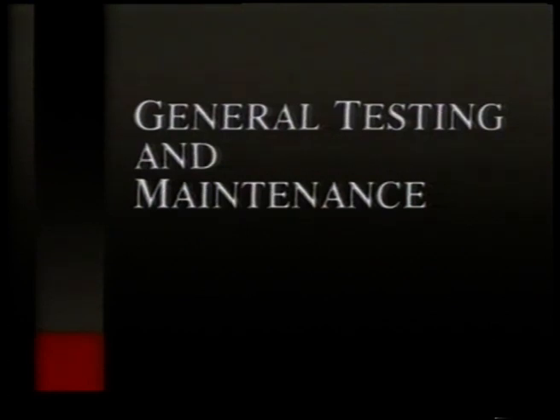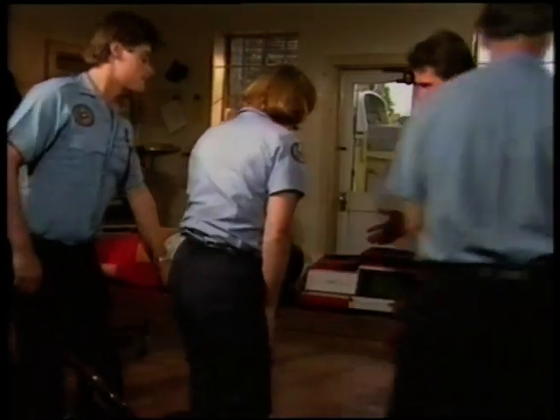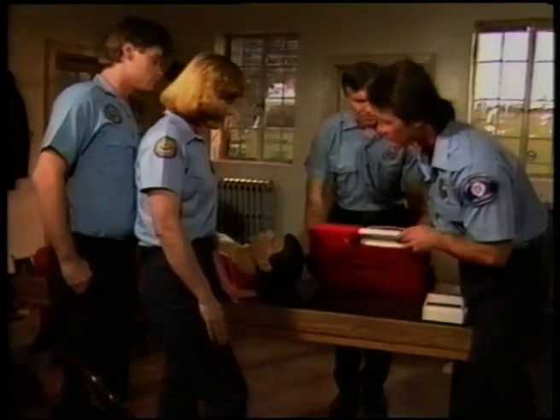The following information is a guideline for testing the functional and electrical safety of the defibrillator monitor. It does not replace the need for a full inspection by a qualified service representative. If the LIFEPAK 300 fails to exhibit appropriate responses during testing, it should be checked by a qualified service representative. Testing should be accompanied by a thorough visual examination for cracks in the case and patient cable.